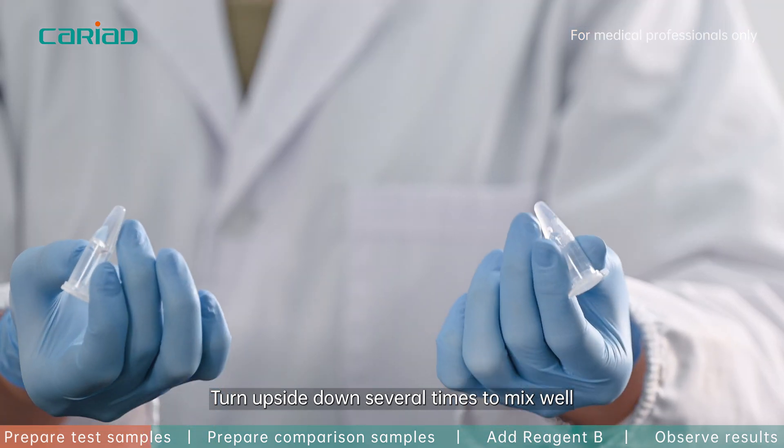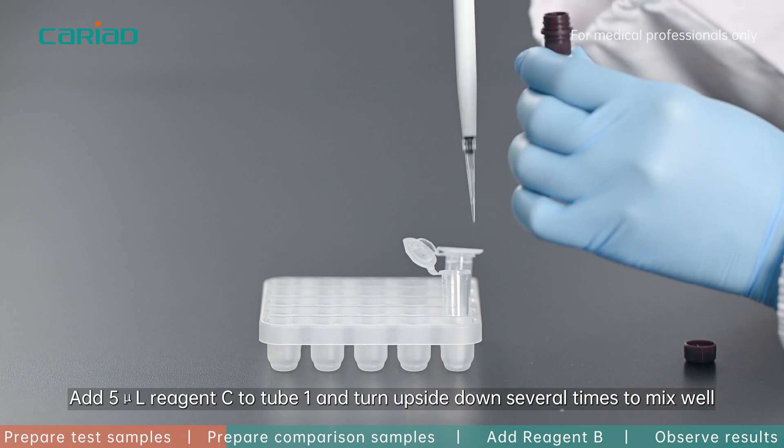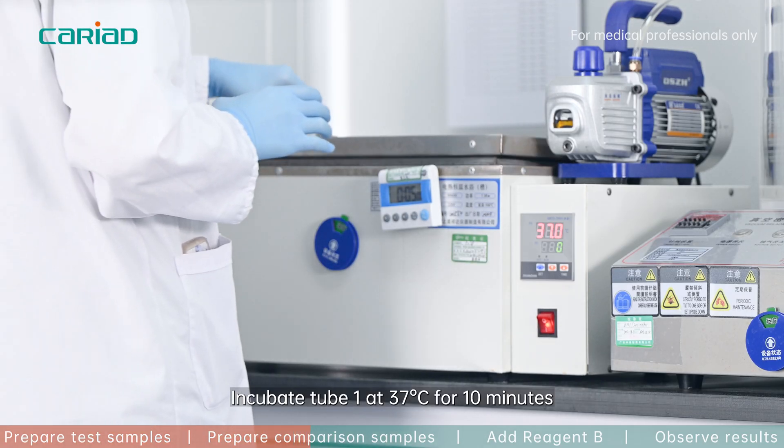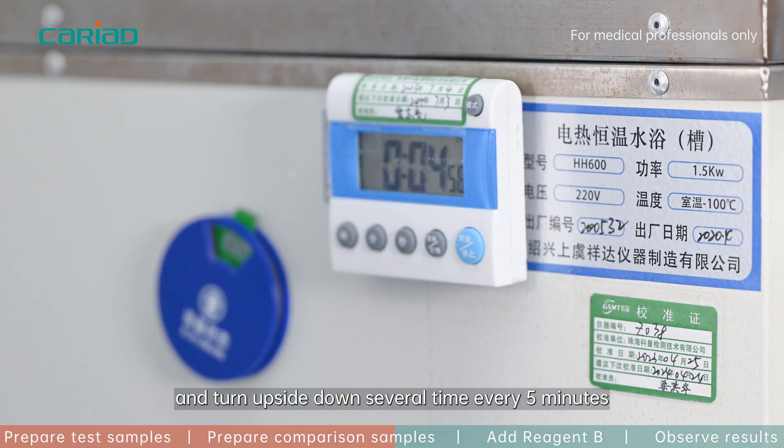Turn upside down several times to mix well. Add 5 microliter reagent C to tube one and turn upside down several times to mix well. Incubate tube one at 37 degrees Celsius for 10 minutes, turning upside down several times every five minutes.